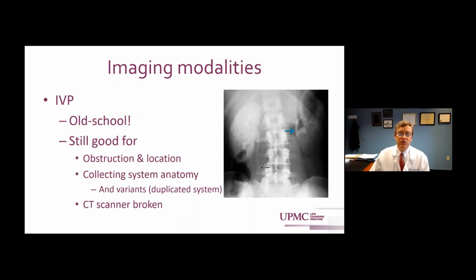So it is useful, and certainly seeing a duplicated anatomy, things that sometimes you have to squint at the CT a little bit if it's a non-con CT, is painfully obvious on an IVP. So great test, almost never done anymore.